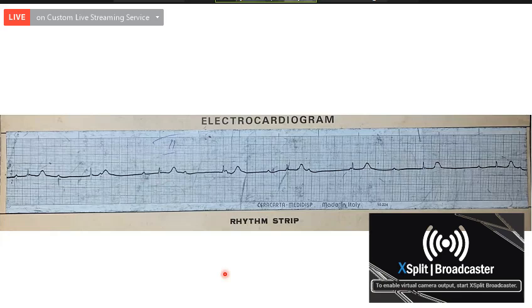When you record the bundle electrogram, if the bundle tracing goes with the atrial tracing, then it is an infrahisian complete heart block. And if the H wave, the bundle tracing, goes with the ventricular tracing, then it is a suprahisian complete heart block. So here it is obvious because the patient is having a narrow QRS complex, and you can easily make out that this is a suprahisian complete heart block. Right. Okay. Very good.